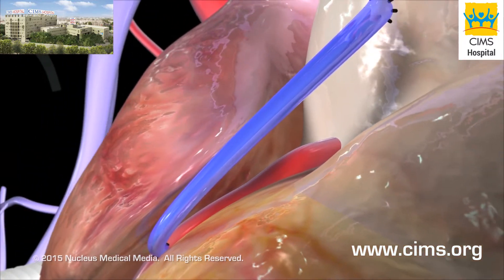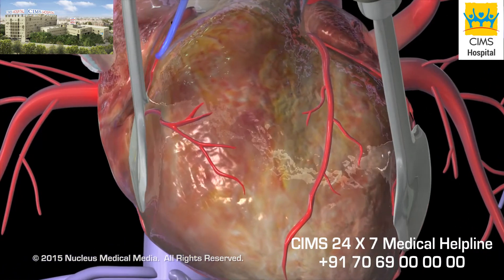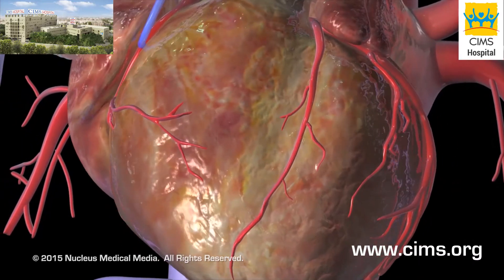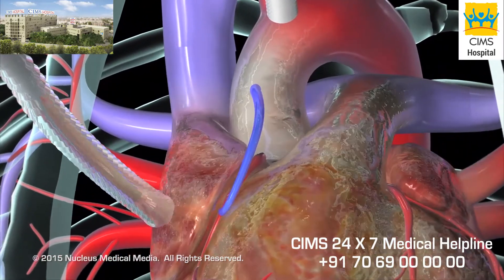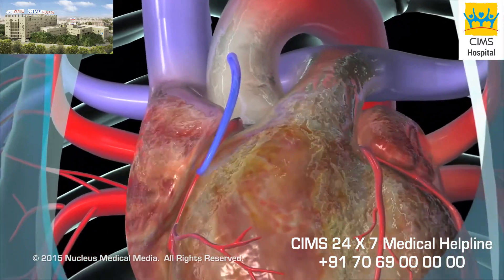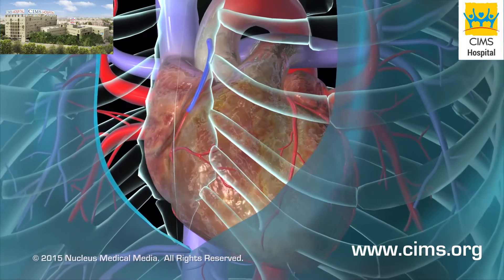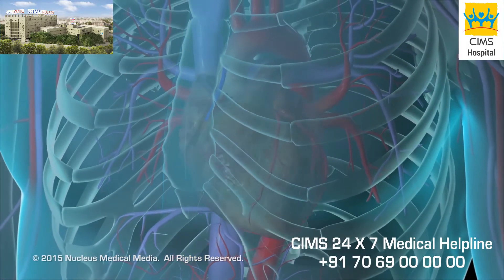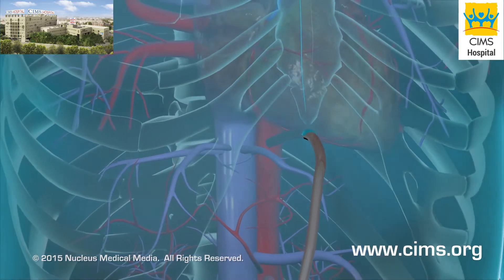With the graft securely in place, your surgeon will use electrical signals to restore the heartbeat and attach a temporary pacemaker to the heart. Once your heart is again beating normally, the heart-lung machine will be disconnected. Your surgeon will wire the breastbone back together and suture the skin incision closed. A temporary drainage tube will be placed through the skin beneath the incision.